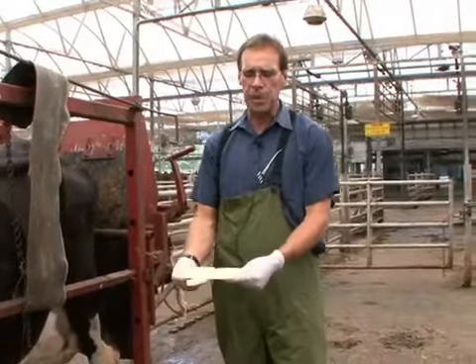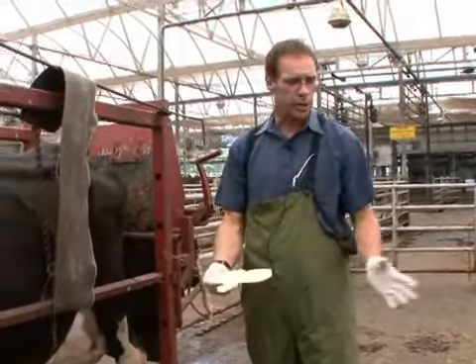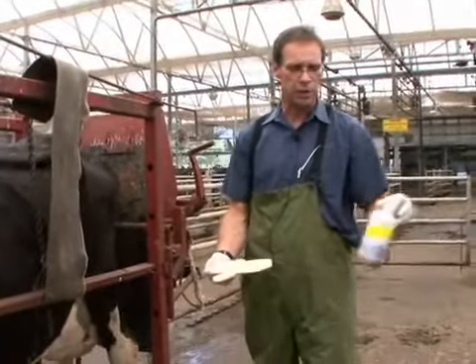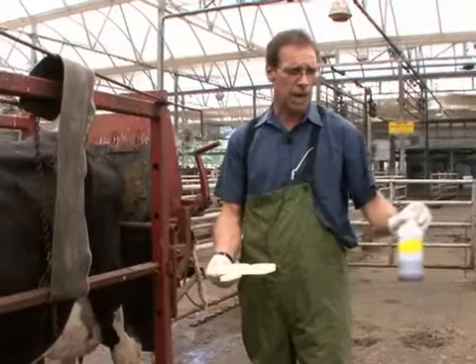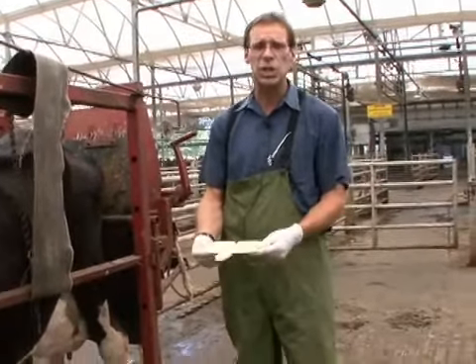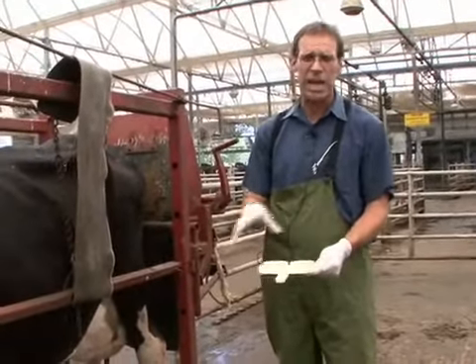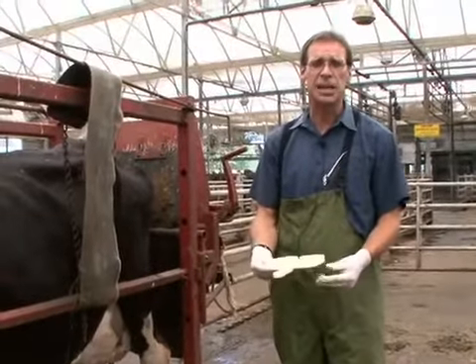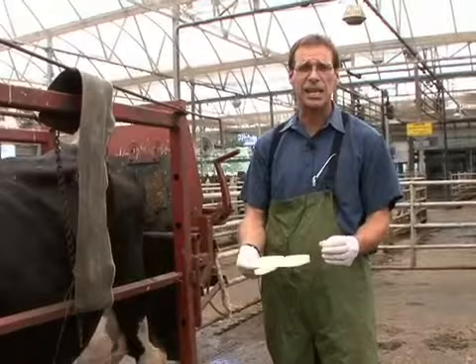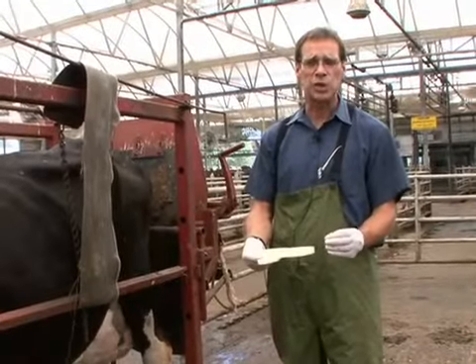Once we retrieve milk from these cattle, we add a reagent which looks like this. It's typically purple, and it contains different compounds, one to test pH, and the other compound will lyse the white blood cells, releasing their cellular contents, which is typically very tacky, and they want to stick to each other.